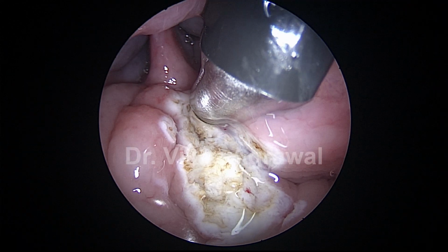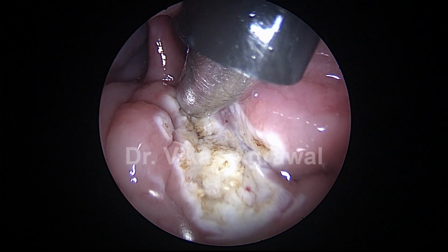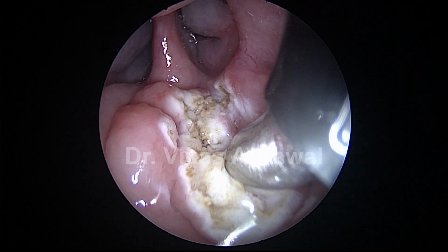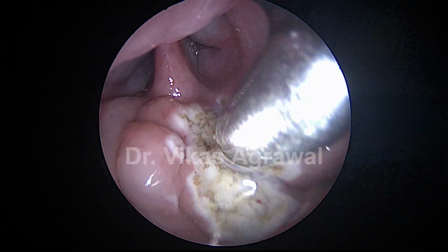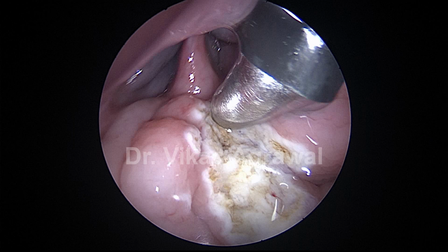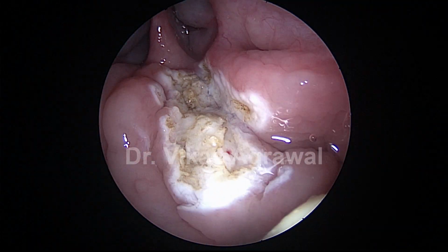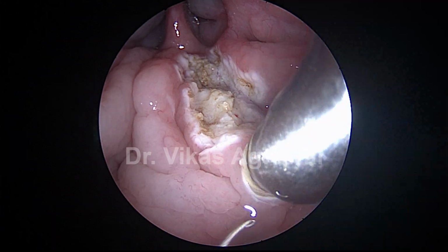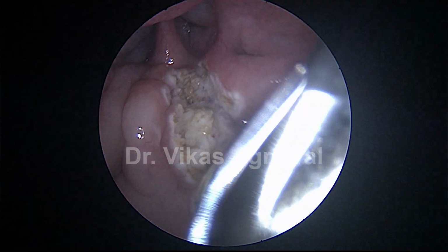So as you can see, when I'm performing surgery from the oral cavity, there will be a little disturbance because of the saline dripping in front of the lens, and it's difficult to make out the buccopharyngeal fascia, so I have to be really careful, otherwise I can open up into the buccopharyngeal fascia.